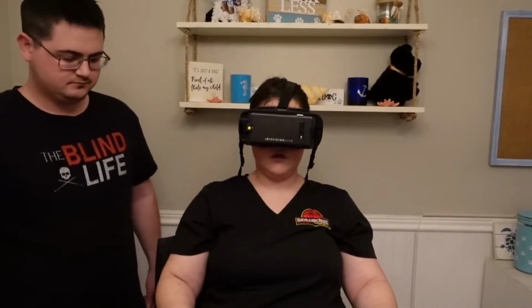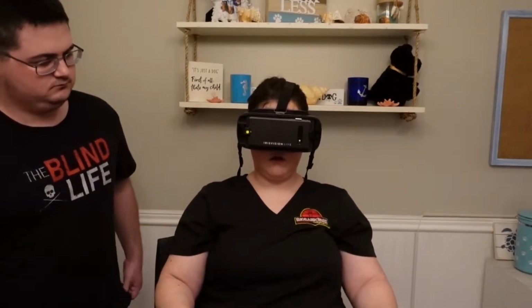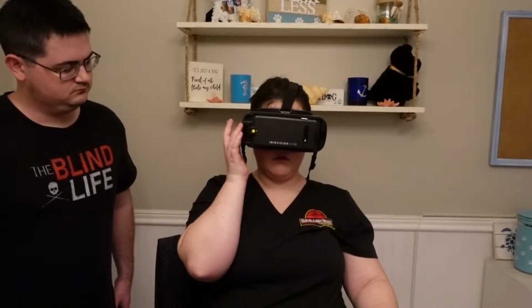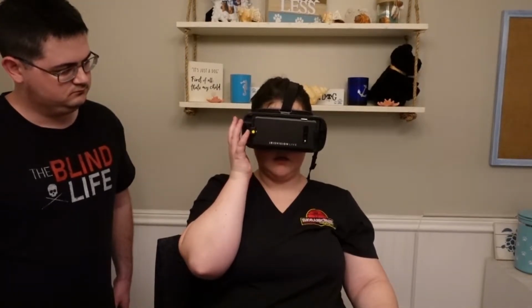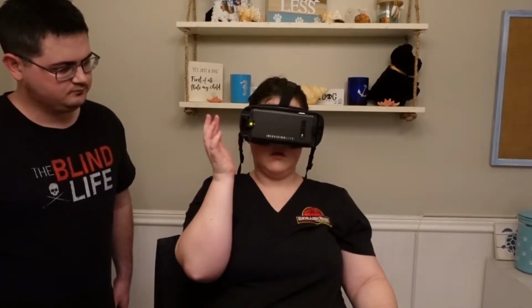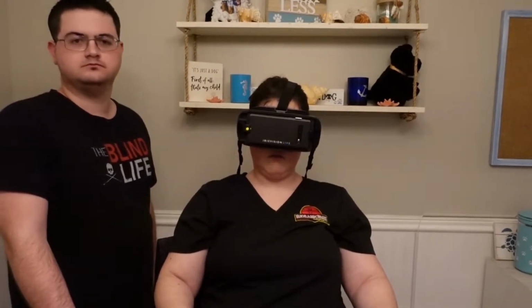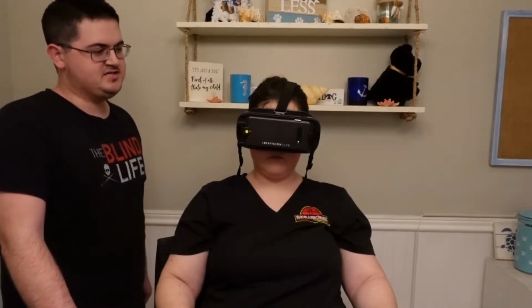With the bubble, you can actually enhance the magnification of that bubble. You would swipe forward to your ear to increase the magnification inside the bubble. Swipe away from your ear to decrease the magnification inside the bubble. Any changes you make in this mode will occur only in the bubble. You can also reposition the bubble, but you have to go to the configuration guide, which we will get to eventually. Alright, so that's scene with bubble.